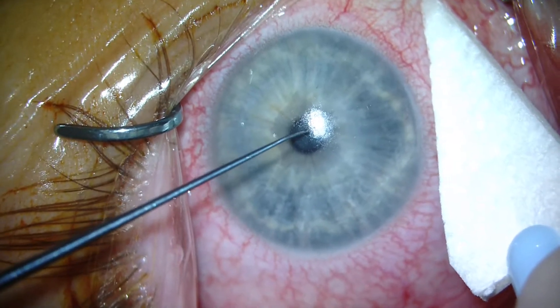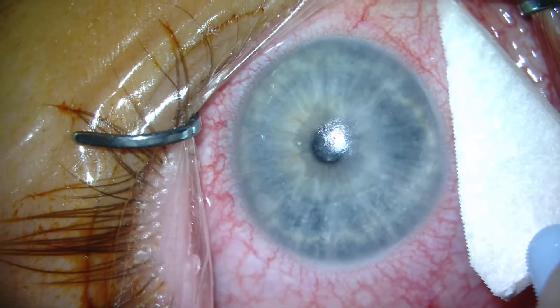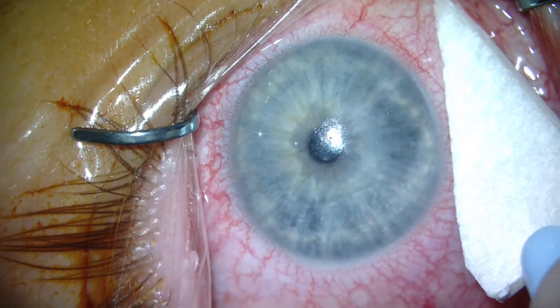Like we do in every Intax case, after measuring corneal thickness at the location of the upcoming incision site, we mark the cornea to help us with placement of the segment.